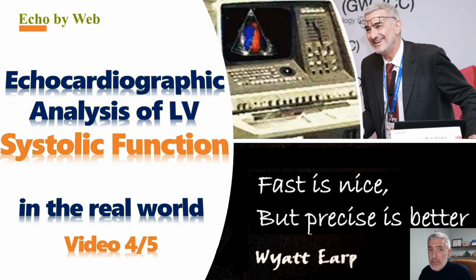The topic of this talk, which spans over 5 videos, and this is the 4th video, is the echocardiographic analysis of left ventricular systolic function and dysfunction as seen in the real world. This is, of course, a basic approach to the topic, which is quite large. Now, these talks assume that you have a basic understanding of how to perform pulsed Doppler and continuous wave Doppler interrogation of intracardiac flow, how to make 2D measurements, and how to use myocardial tissue Doppler. It also assumes that you know how to perform the basic echocardiographic measurements. However, as mentioned before, you can refer to the echobyweb.com website for a large quantity of teaching material that addresses these topics.